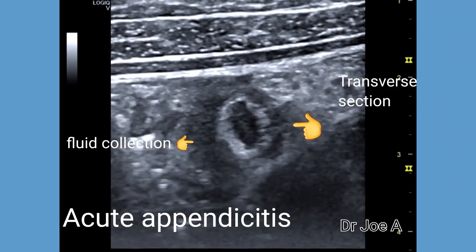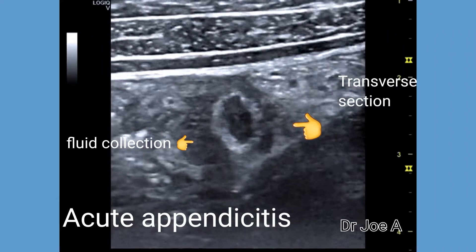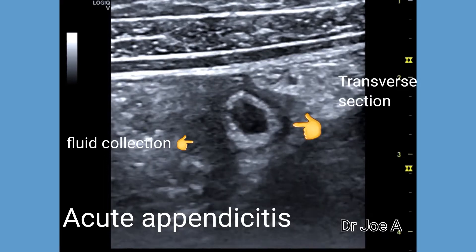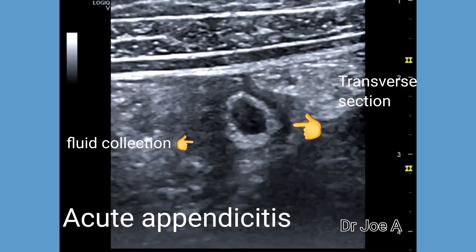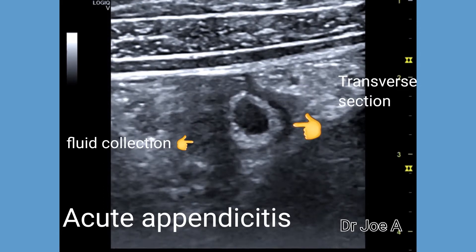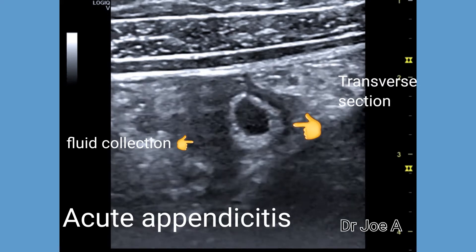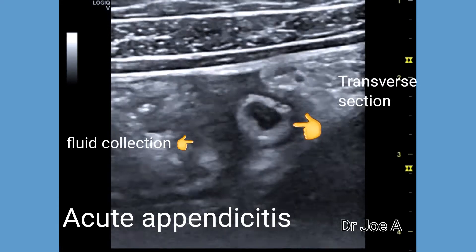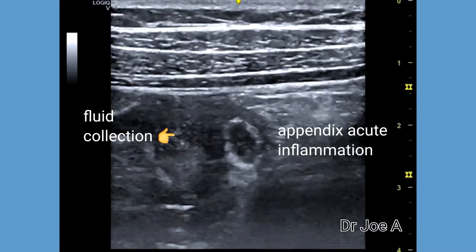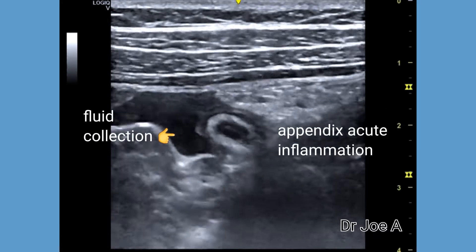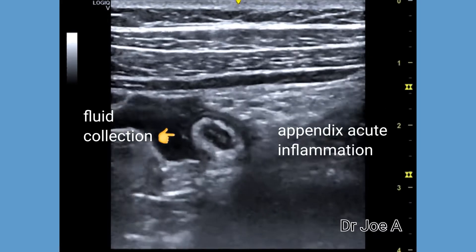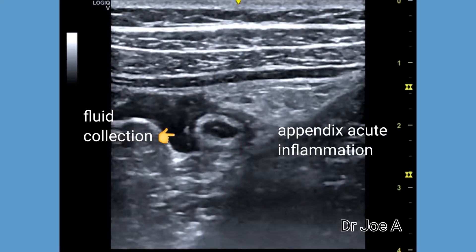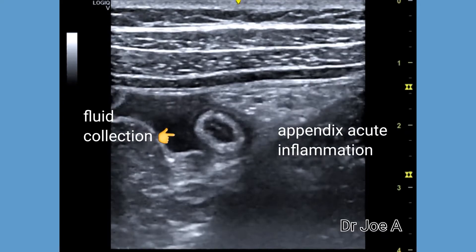This is a case of acute appendicitis in a young adult patient. The appendix in cross-section is seen here measuring more than 7 millimeters in diameter, with fluid collection around the appendix. The appendix cannot be easily compressed. These are all classic signs of acute appendicitis.